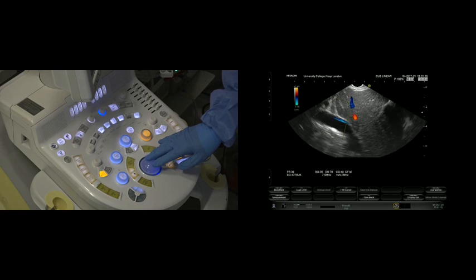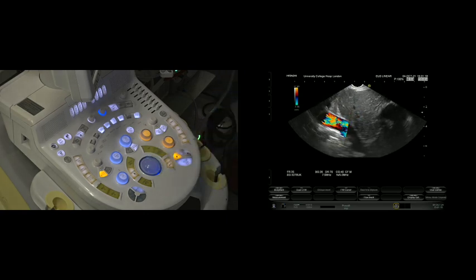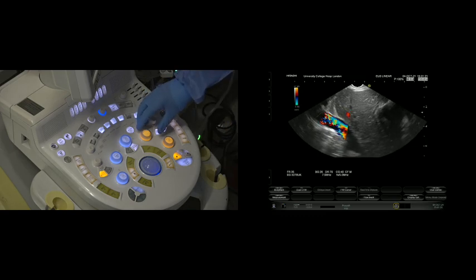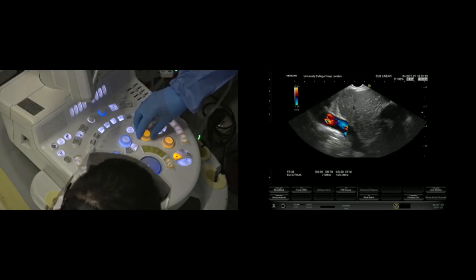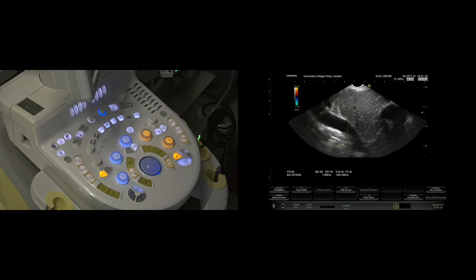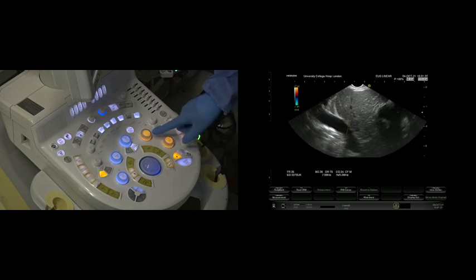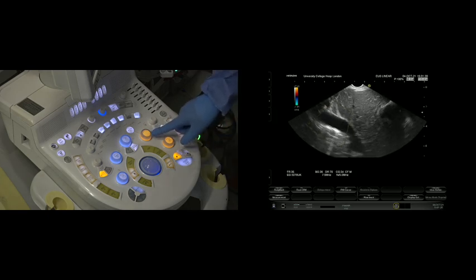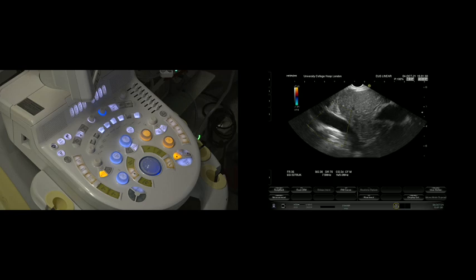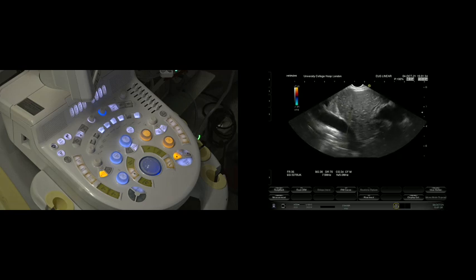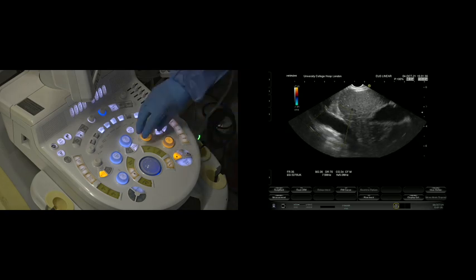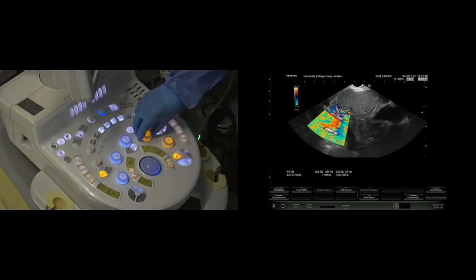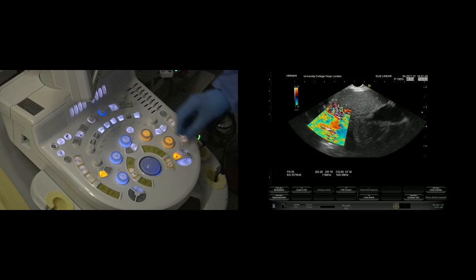Just be mindful that the Doppler also has a gain. If you dial it all the way down, if inadvertently the Doppler is dialed down, you might mistake that for a non-vessel, i.e., maybe a bile duct if you're looking in the wrong deck. That's obviously an issue. Similarly, if you put the gain all the way up, it's a real mess.